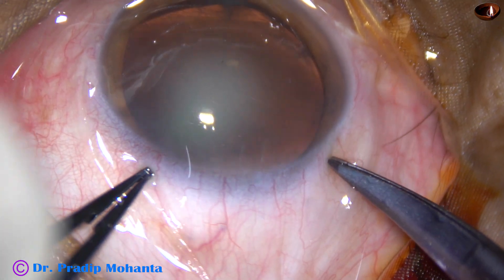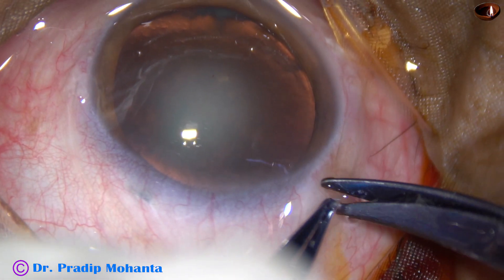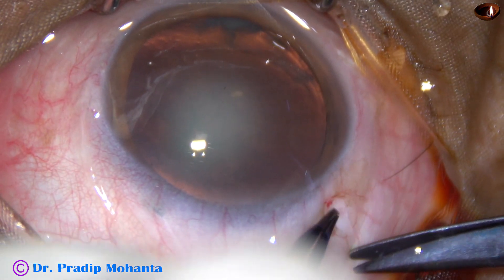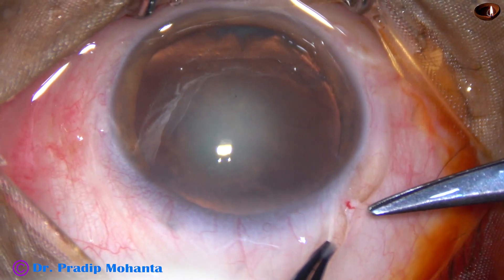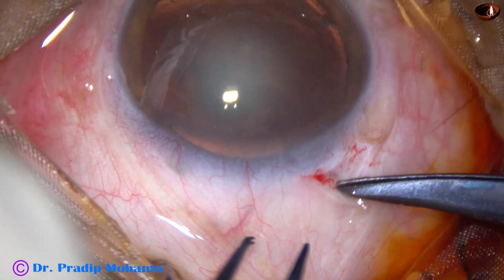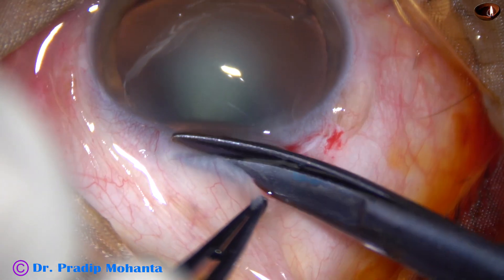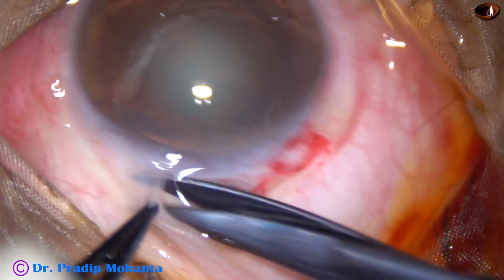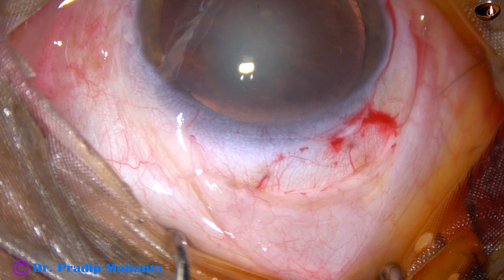We can see this is not a hard cataract, so we don't need a large incision. This incision is about 5.75 or 6 mm. Make a small radial cut, go over the scleral surface, take the tenons, go between the tenons and the sclera, and make this incision along the limbus and over this peritomy. This peritomy is enough.